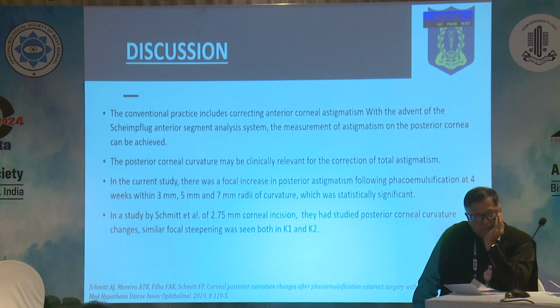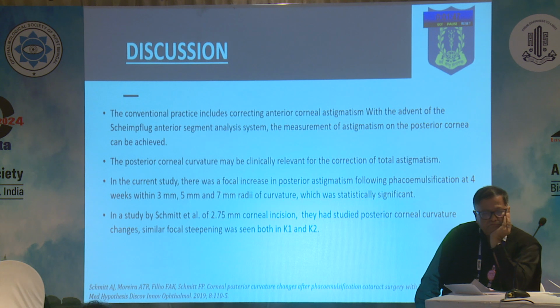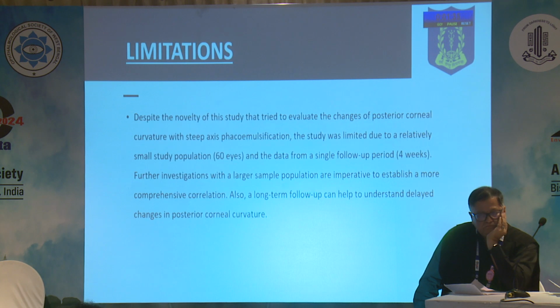So, as per the conventional practices, only the anterior corneal astigmatism was corrected, but by the Scheimpflug imaging system, now we can take into consideration the posterior corneal curvature also. And studies have already started publishing, which have shown that there has been an effect, and there has been focal steepening because of the effect of phacoemulsification on the posterior corneal surfaces.